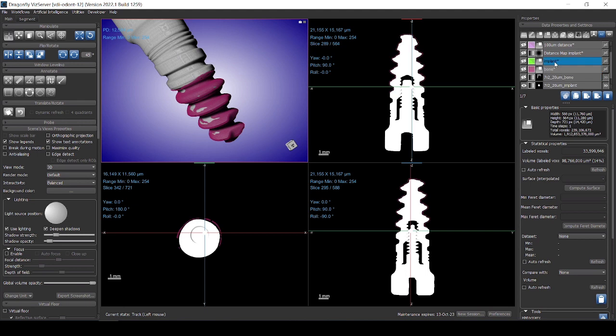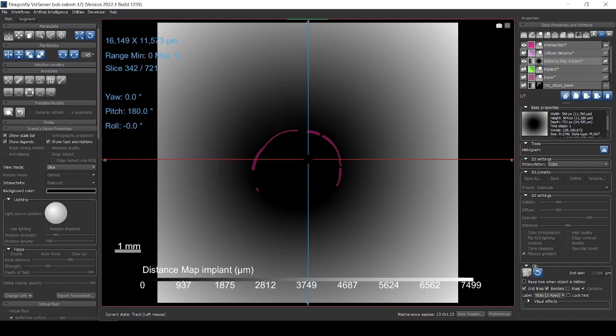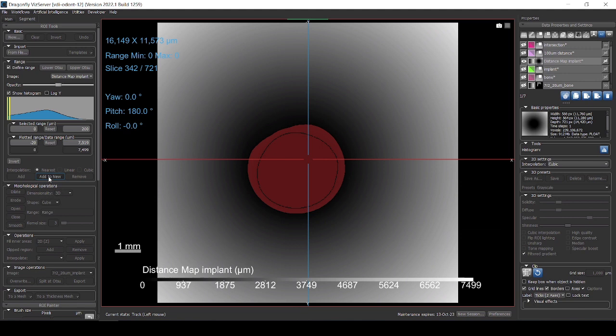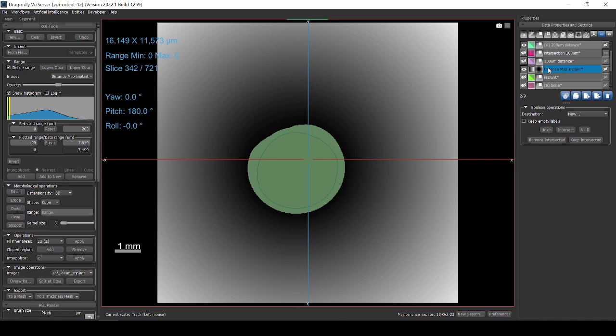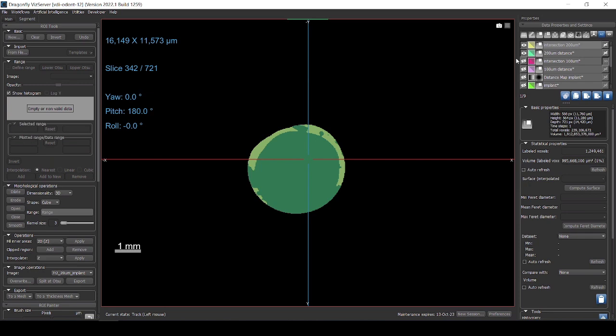What is also interesting is to get the distance map again. Let's go back to here. Get the distance map. Let's see it. Let's get rid of this for now. A range of 200. And then I select again, let's write it down as 200 distance. And then now I do again this 200 intersecting with bone. And I create a new label. That's going to be the intersection 200.